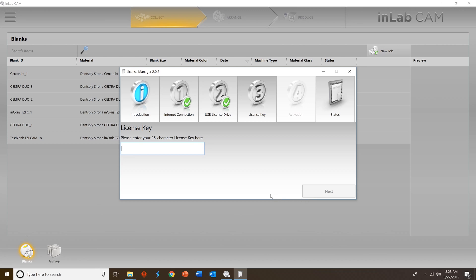Enter the 25 character CAM license key that you receive from Dentsply Serona. Then press next or enter to start the activation process.